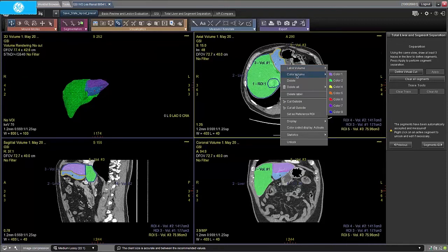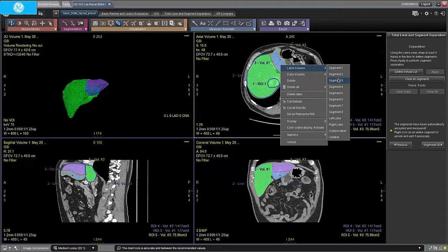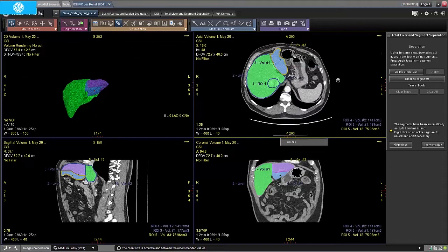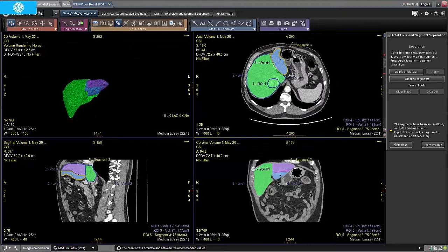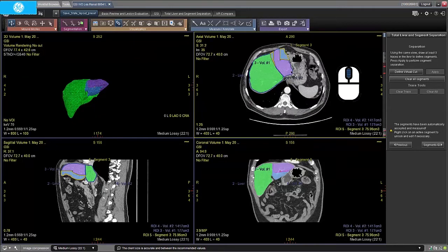In this case we will label the right lobe and segments 2 and 3. Please note that this is just an example and anatomy segmentation may not be entirely precise.